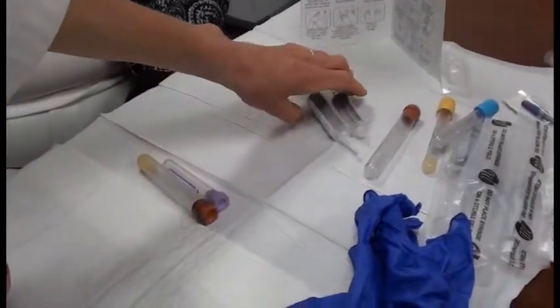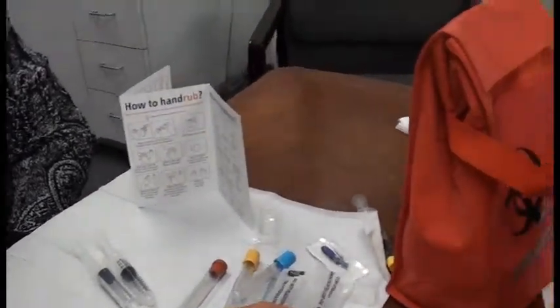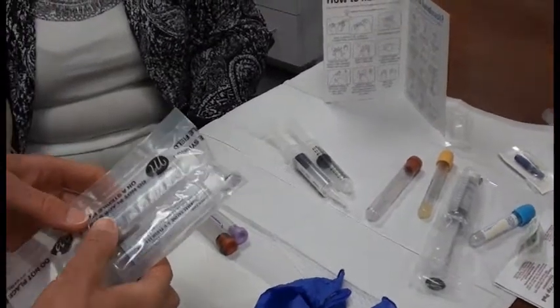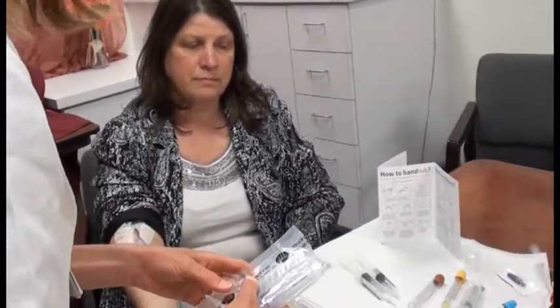For flushes, if you have TPN, you'll need 2 additional for a total of 20 mLs of flush per port. If you have TPN, you must first stop the TPN, disconnect the TPN, and then flush each port with 20 mLs of saline. So you could end up with a lot of flushes if you had TPN actually running when you arrived at the patient's home.